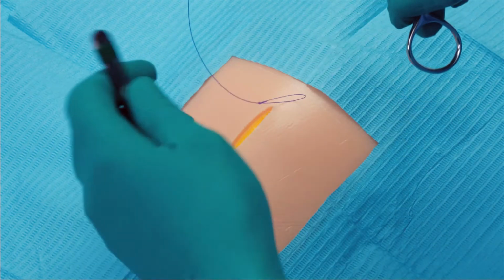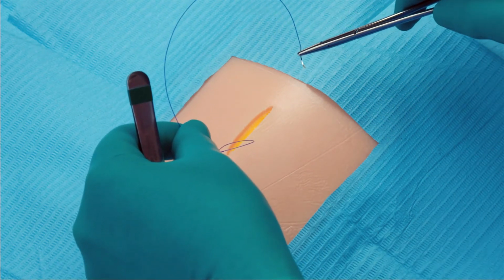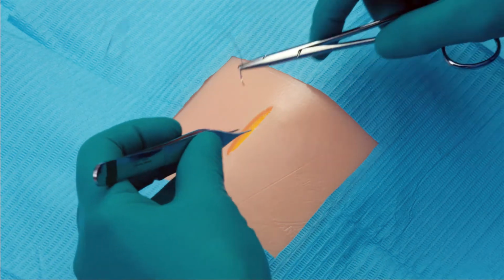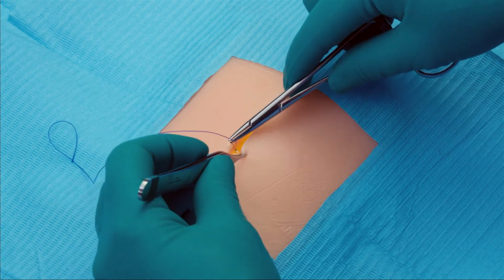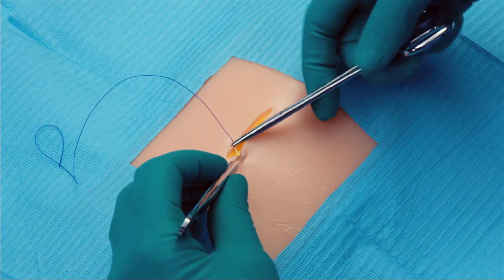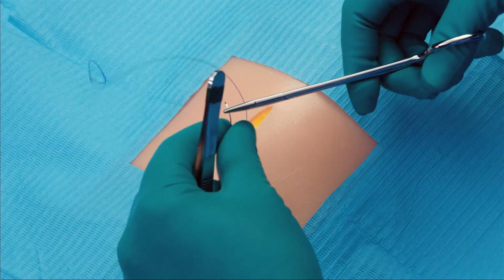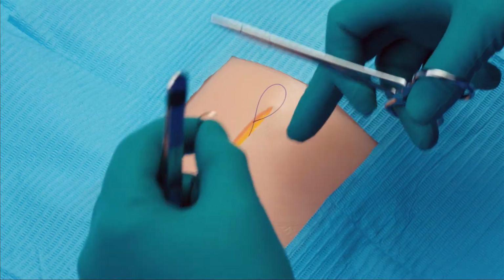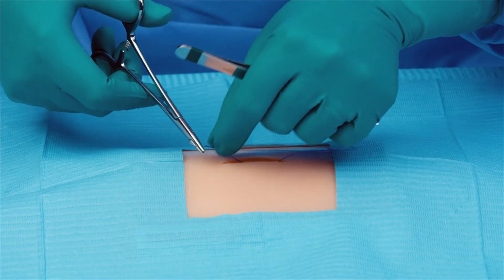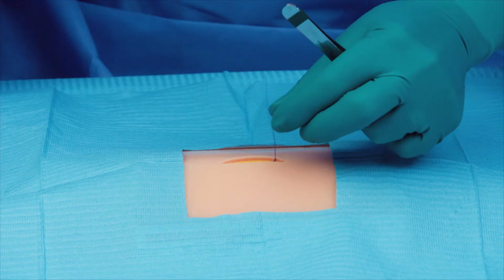So with this suture, I'm going to do a whole layer of deep sutures and then come back and do a whole layer of superficial sutures. We begin by taking a bite of the designated anchoring tissue medial to the apex of the excision. Pass the needle through the variable loop and pull in order to tighten the loop and create the fixation point.